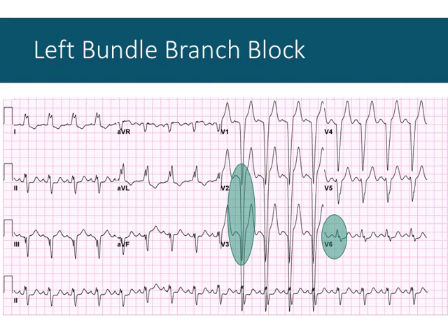So that's entirely possible. Have you ever discovered anyone's arrhythmia or anything in lab? We haven't, even though the ECG will tell you that there might be something wrong. It automatically diagnoses. You're about to die. It automatically diagnoses sometimes right atrial hypertrophy or a different axis than normal. And I largely chalk that up to improper placement of the electrodes.